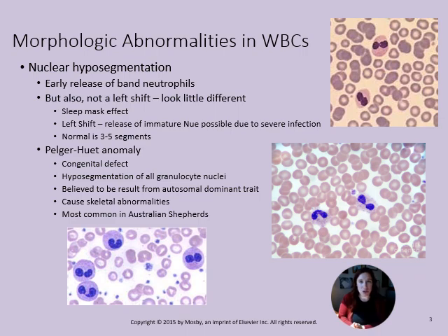Okay, they look a little bit different. They look almost like a sleep mask at night, or like an 8, okay? They're two different things, so they're under-segmented. So what is an example where we would see that?